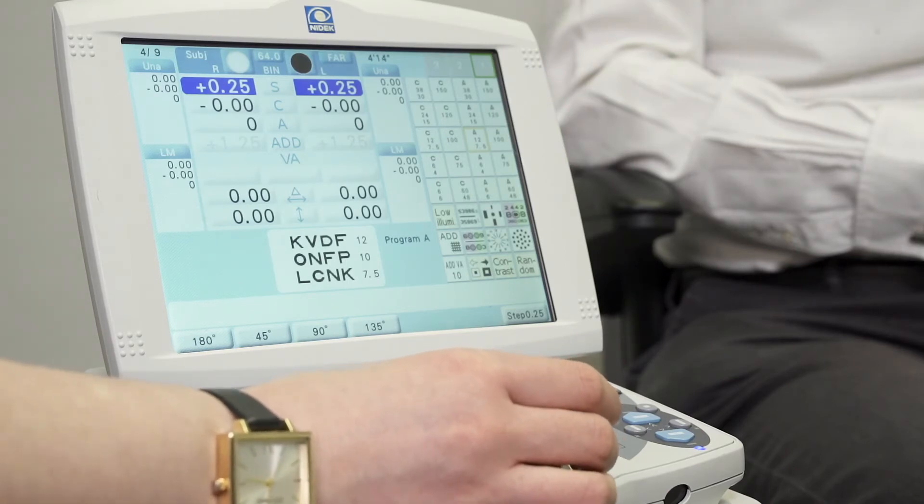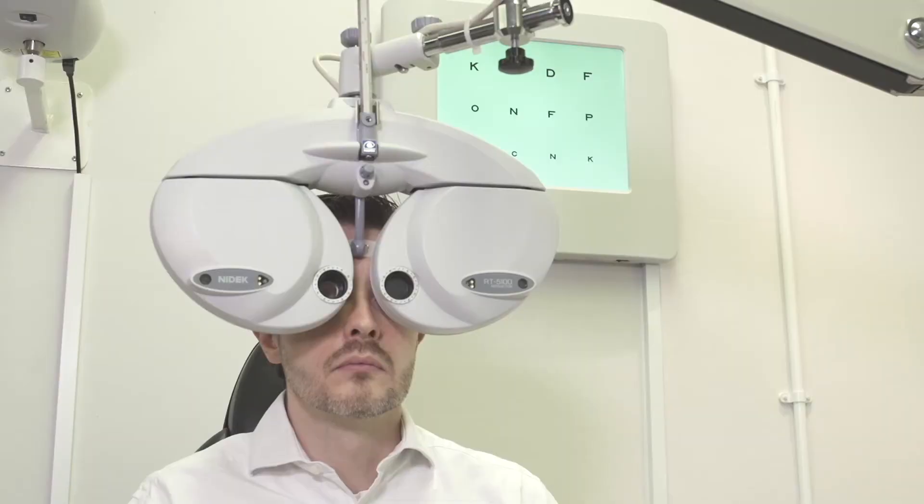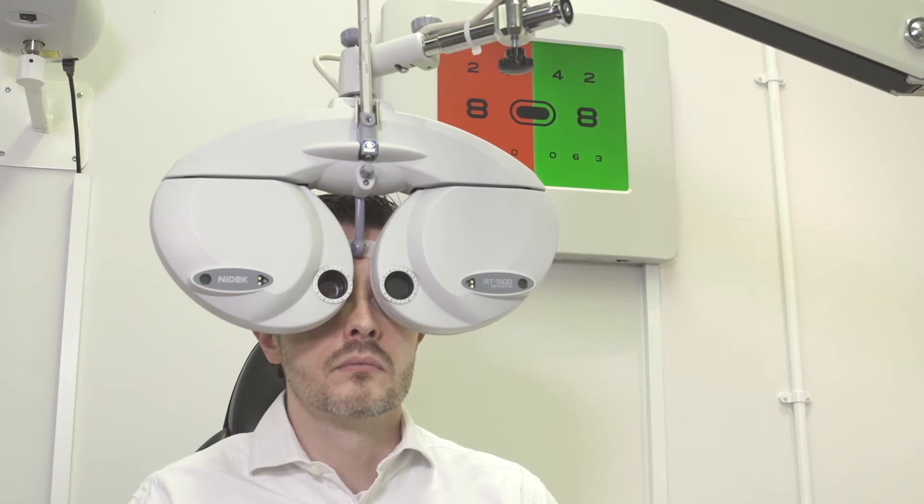Once we're happy that we've got their sphere as best we can, we'll move on to the duochrome test, asking the patient whether the letters and the numbers appear clearer on the red or the green.